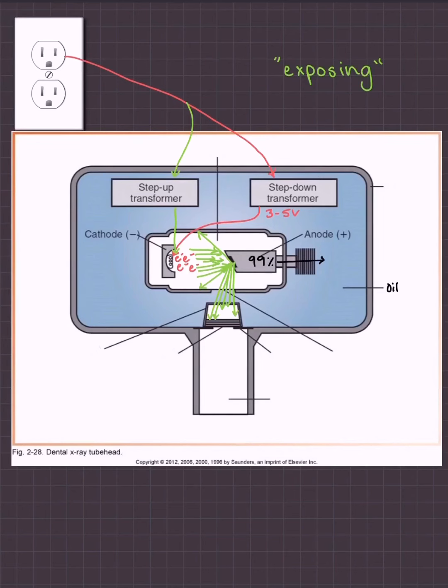The X-rays produced are emitted in all directions, but because of the lead glass casing of the X-ray tube, a very low number of X-rays can exit through the small unleaded glass window. They then go through the tube head seal and the aluminum discs, removing or filtering the longer wavelength X-rays. The lead collimator restricts the size of the X-ray beam, which then travels down the PID and exits the tube head.